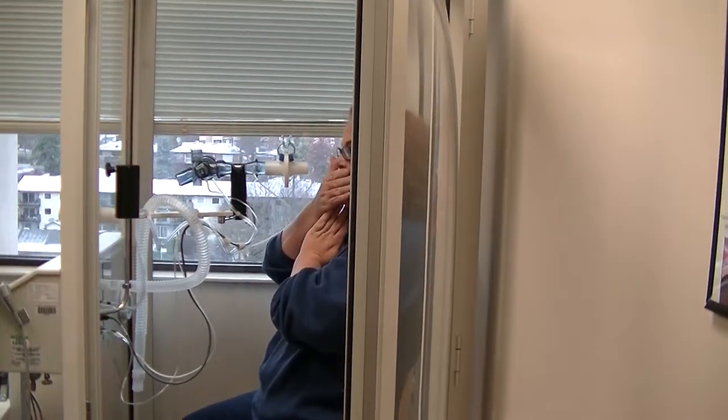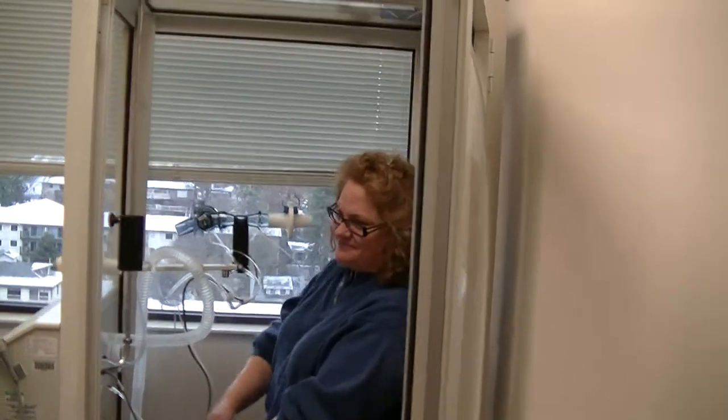You're hired — that means you get to stay here all day and do it for me. No thanks. Good job. It's not fun breathing, is it? Nothing like that.